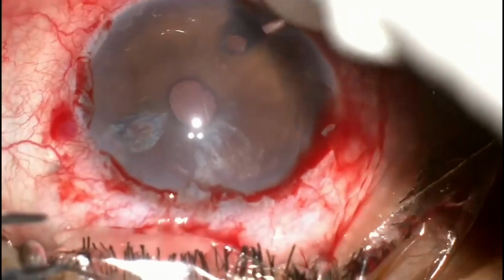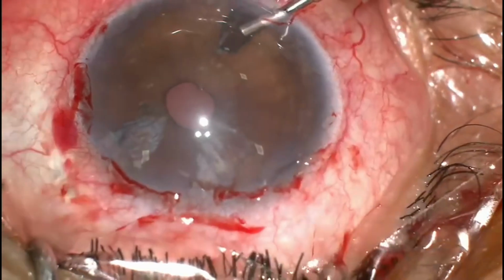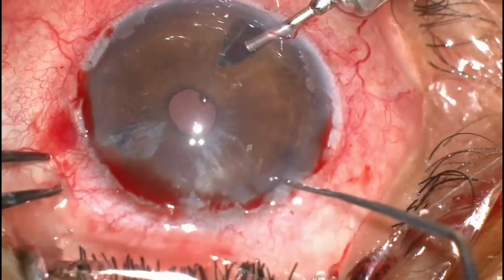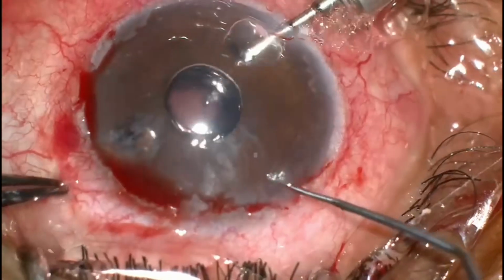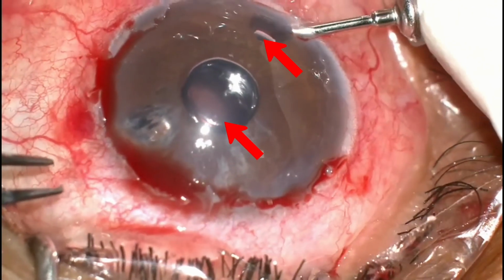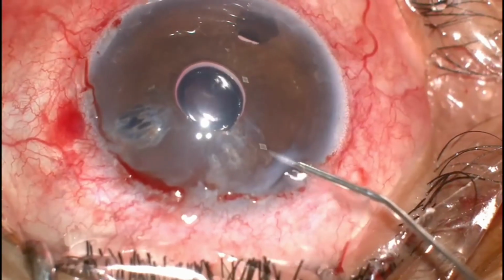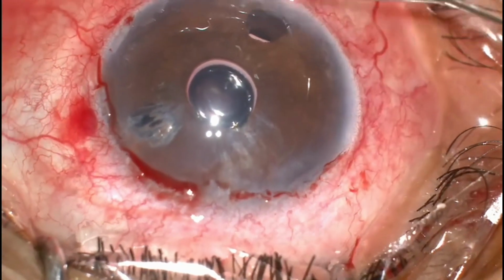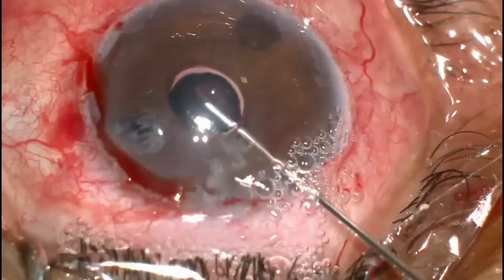And I put in my AC maintainer and do a partial entry incision there. And I'm trying to put in air to try and do the descemetorhexis over here, but as you can see, the air keeps escaping behind the iris and it's shallowing my anterior chamber, and you can see me here trying to egress that air out from behind the iris.